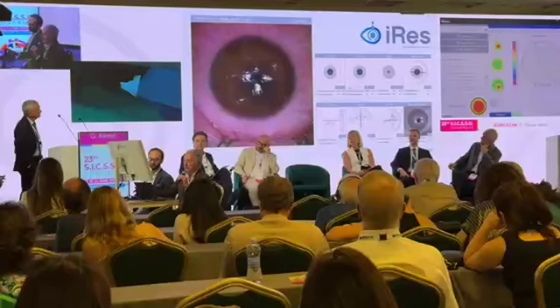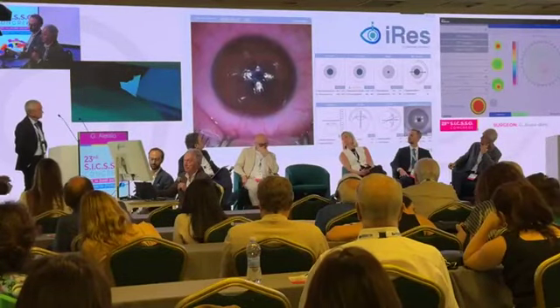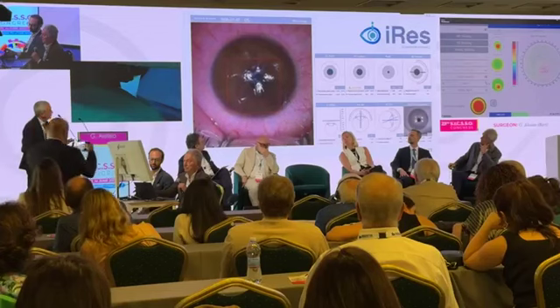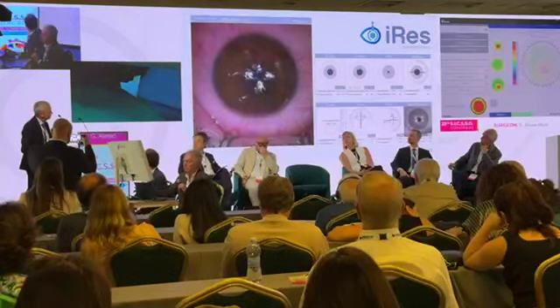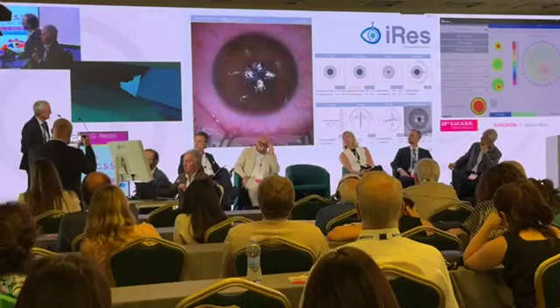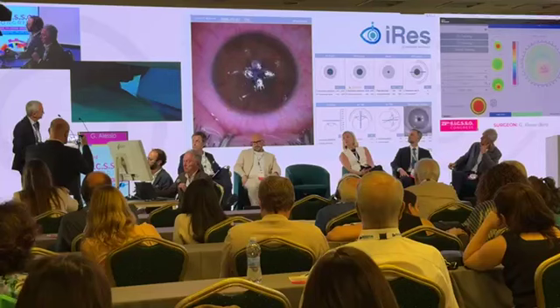The laser is started. Here you can see on the apex of the cornea it is running. The speed is extremely low now because it's working in a very delicate area. The speed goes from 2 Hz up to 2000 Hz, and the speed increases to grant constant fluence per square millimeter in the cornea.